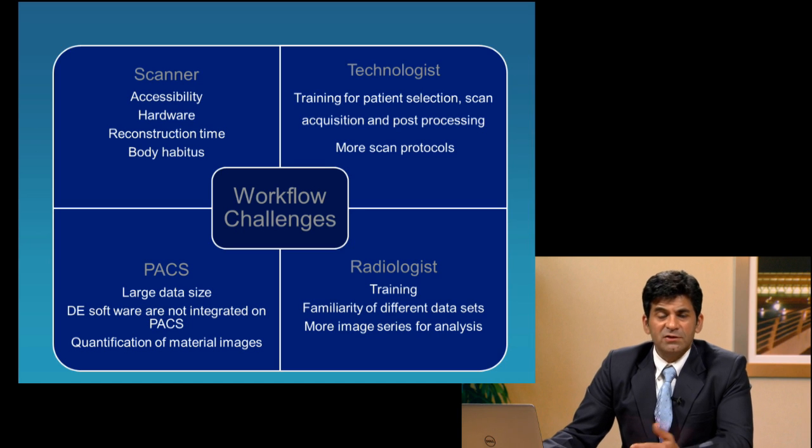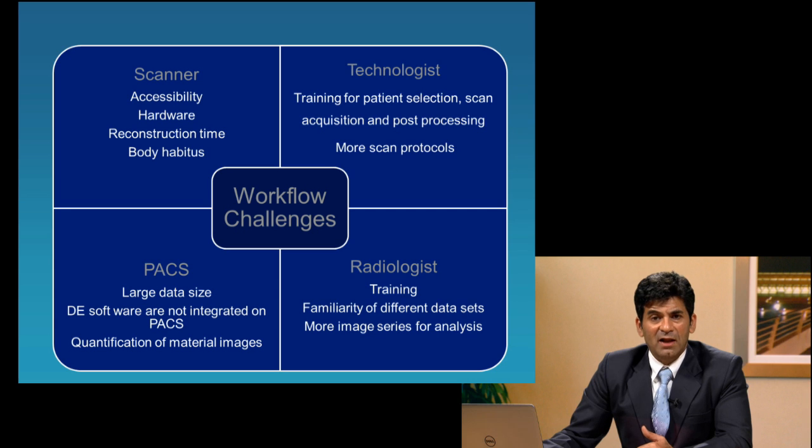There are certain considerations, like with any new technology, workflow being an important one, and they are also relevant to dual energy CT. There are challenges with scanner availability, given dual energy is not a routine application yet. Only some of the scanners have these capabilities, so it's challenging for us to schedule some of these exams. The technologists need to be trained with the scanning and post-processing.